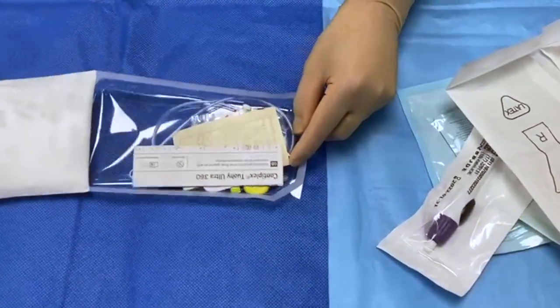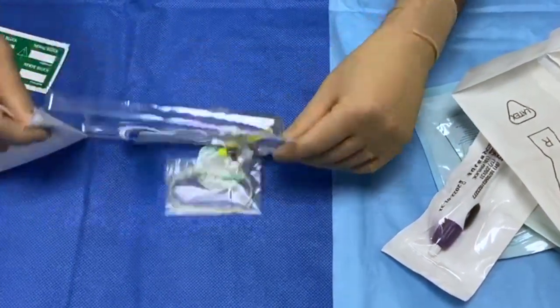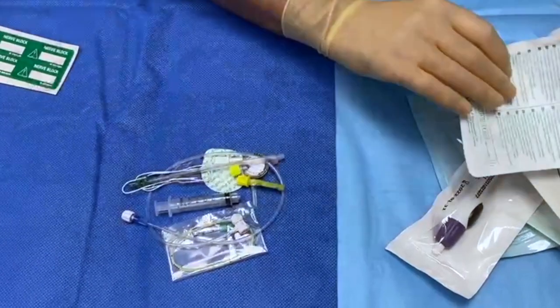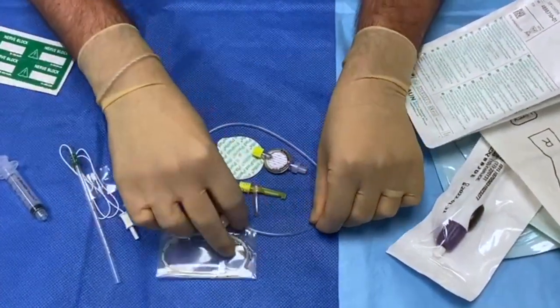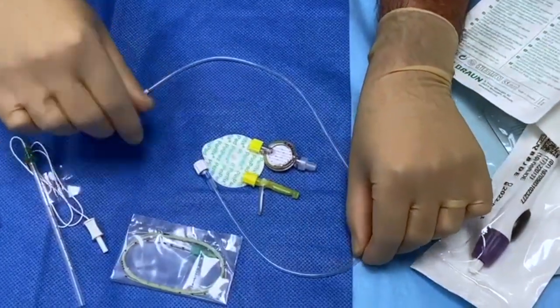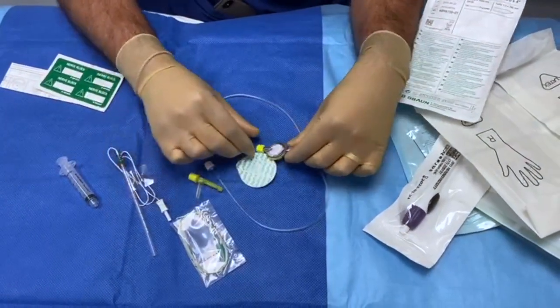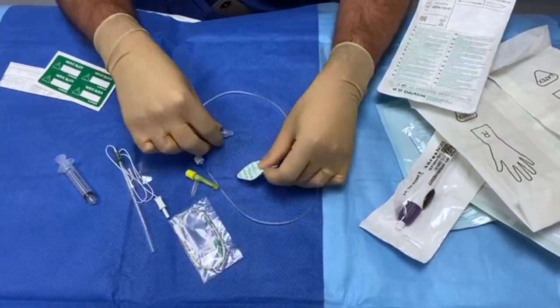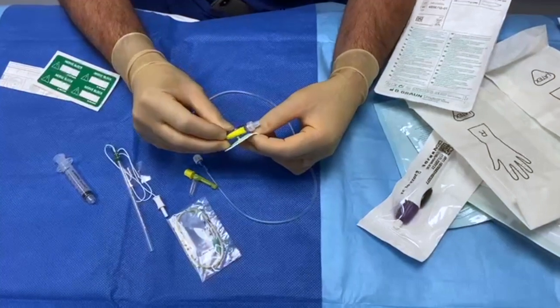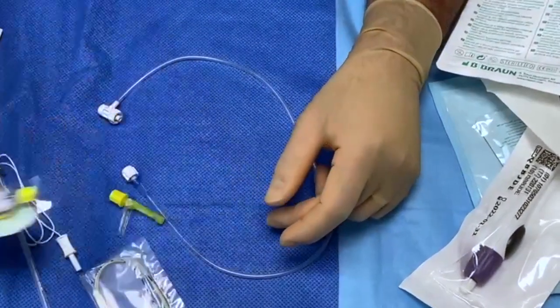I open up the package and empty the contents onto my sterile trolley. Within the set it comes with a needle, a giving set, the catheter itself, the catheter clamp, a filter, and a device used to clamp into the back of the filter — that clamps in like that. So I'm going to move this to one side.